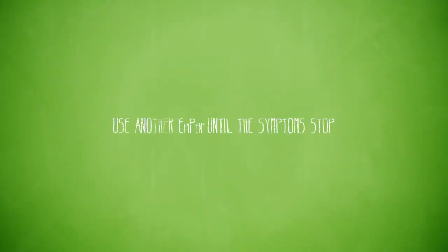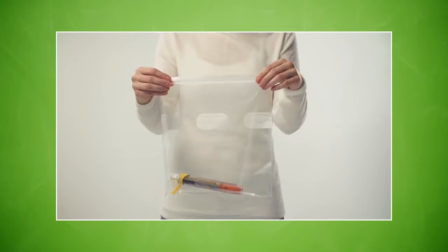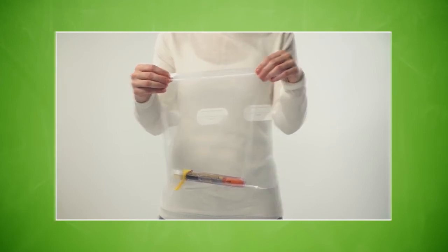If your reaction continues or your symptoms return before you receive medical attention, it's okay to use another EpiPen until the symptoms stop. Remember to bring all the used EpiPen auto-injectors with you to the hospital. Give them to a healthcare professional for inspection and disposal.